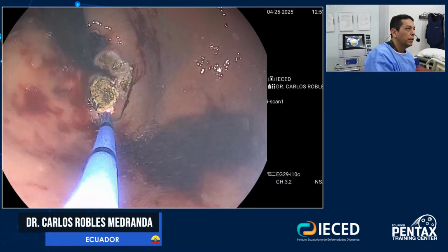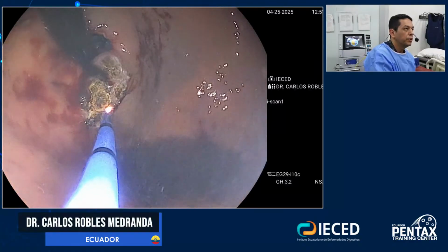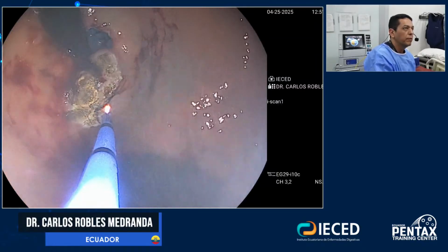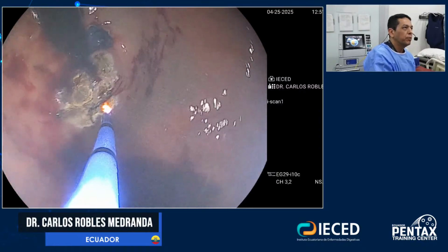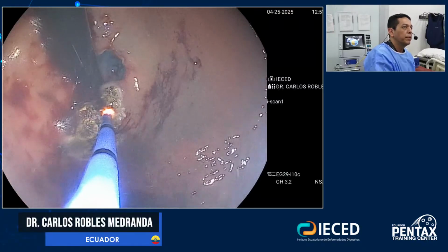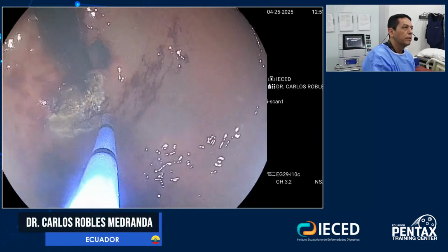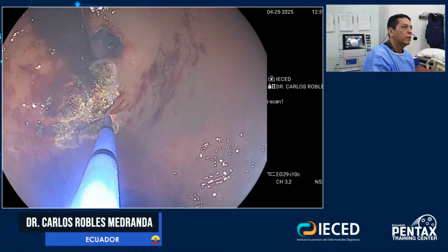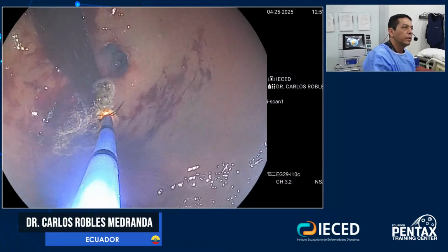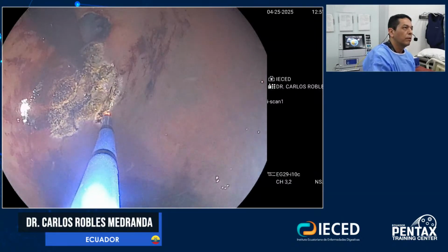I start very near to the sphincter. There are some authors that say we need to respect the sphincter. I believe if you are okay, you can be borderline, in my opinion. I'm not so sure about that, you know. So I am burning very well. I am using forced coagulation 4.